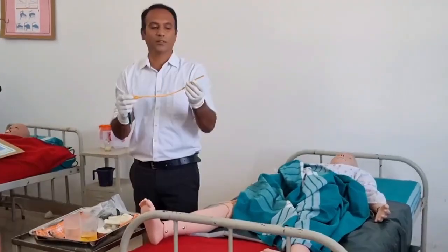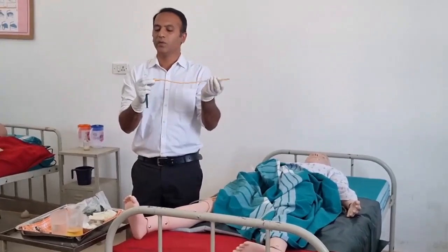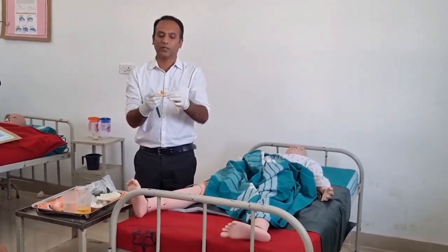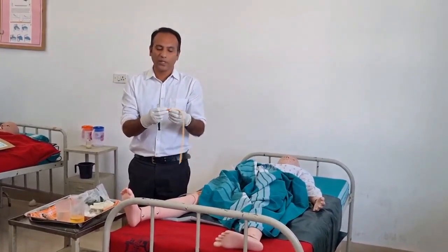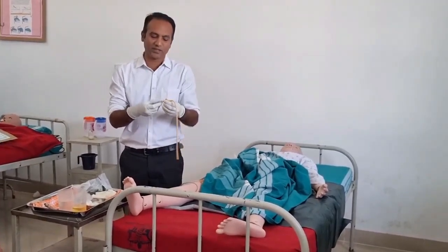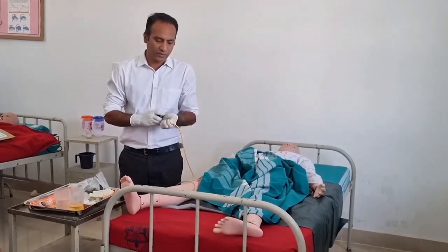This is an indwelling catheter, Foley catheter, having two lumens. One is for draining the urine out from the bladder, and the other channel given here is for inflating the balloon. Right? Here the recommended volume is 5 ml, but we do 10. How much? 10. Yes. We usually inflate with 10 ml.